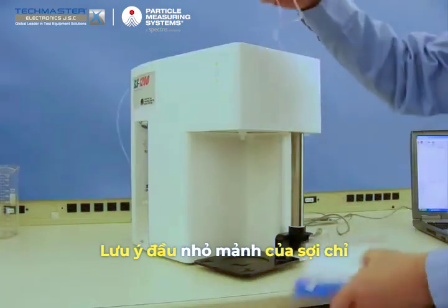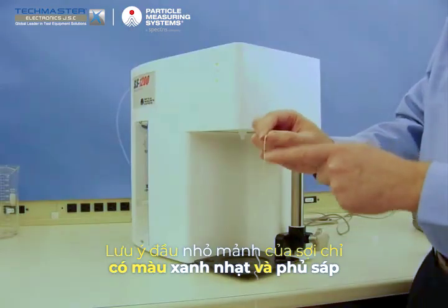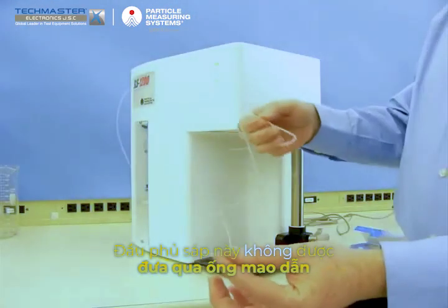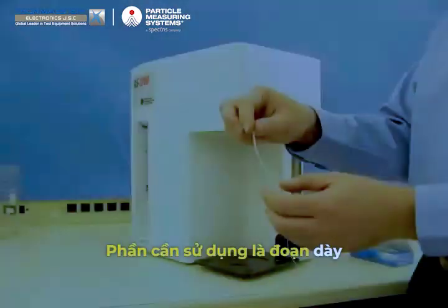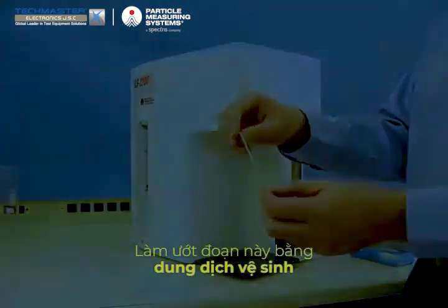Notice that the shorter, skinny end of the floss is slightly bluish in color and appears to be coated in a wax. This end should never pass through the capillary as the wax can be deposited on the cell walls, therefore adding steps to the cleaning process. What is desired is to wet the fat section in the middle of the floss with the cleaning solution.